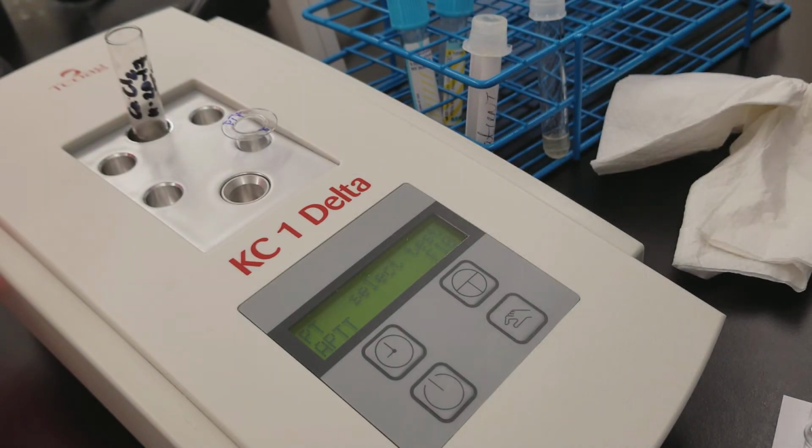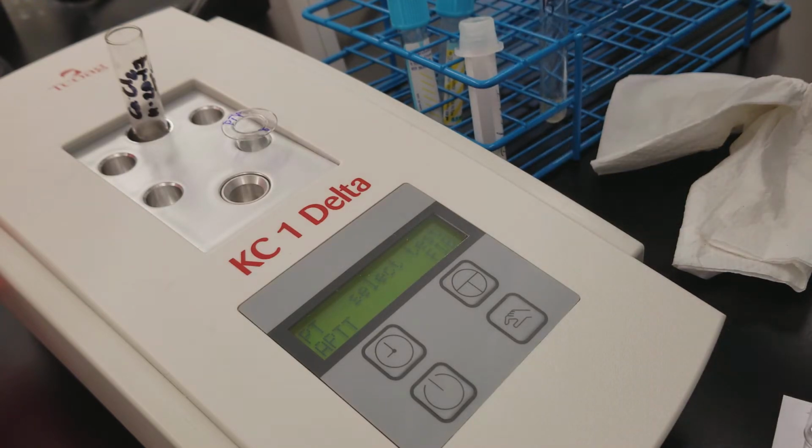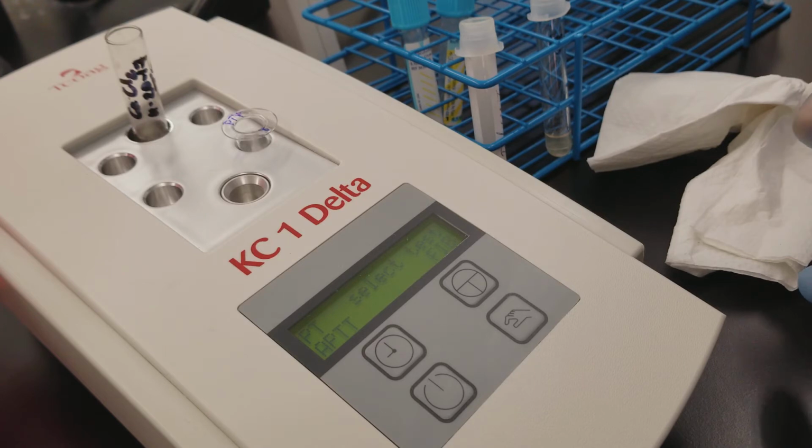You would never ever, I want to clarify this, you would never ever put a clotted specimen intentionally on your analyzer because you could ruin the analyzer. You'll end up putting a clot in that specimen probe, and you're going to be in for a rough day if you do that. So if you want to enjoy a great day at work, don't do that. And also, you'll affect the patient's results, and that's absolutely unacceptable.